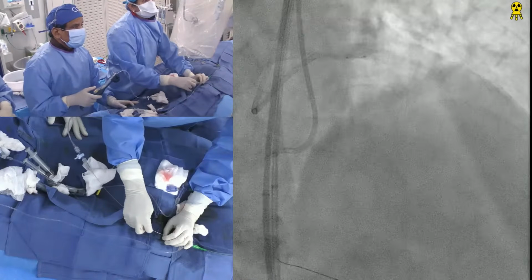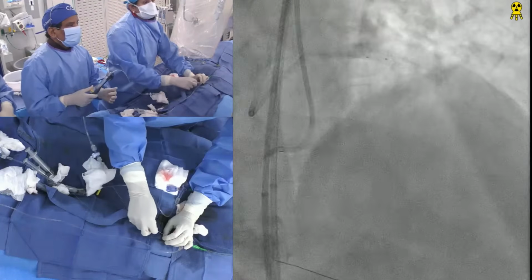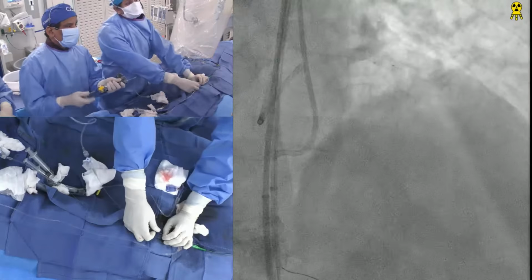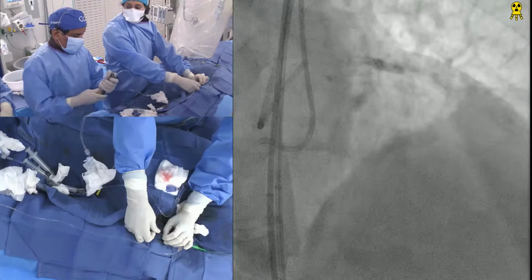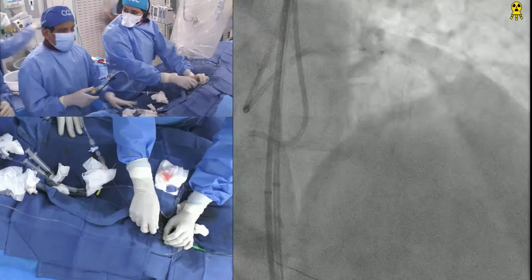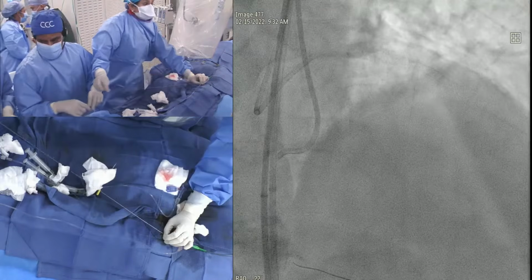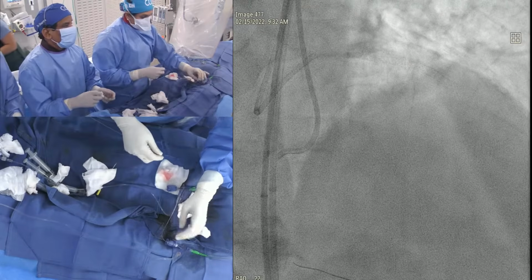Yes, a lot of calcium here, but it's not stented here. Not stented. Yeah. Gritty feeling there. Good. Go up here. See that the whole thing is not a... Okay, down. Now get me that 1.2 by 8. I think if that doesn't go, we call it a day. Yeah. 1.2 by 8, yeah. We are still at 2.2 gray, milligrays with total radiation.